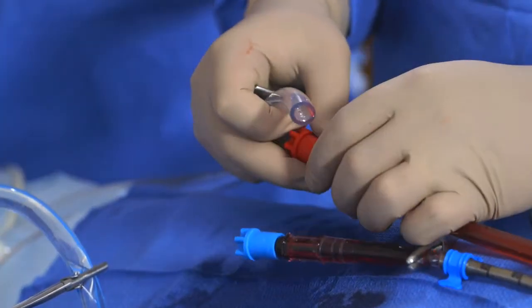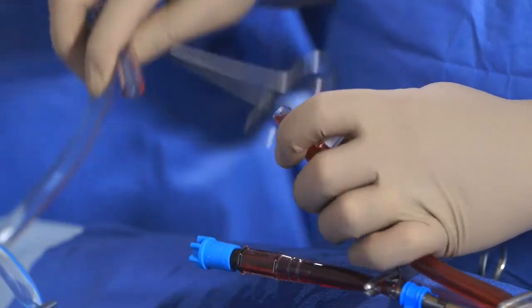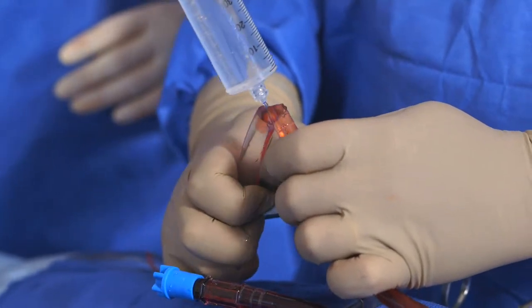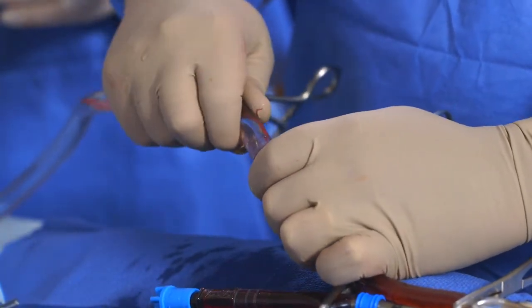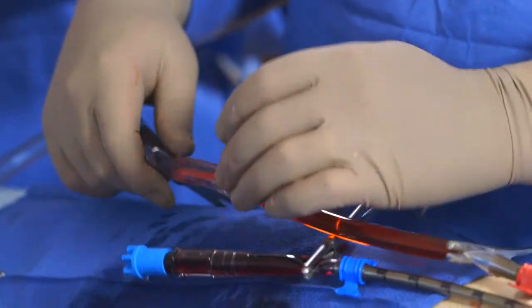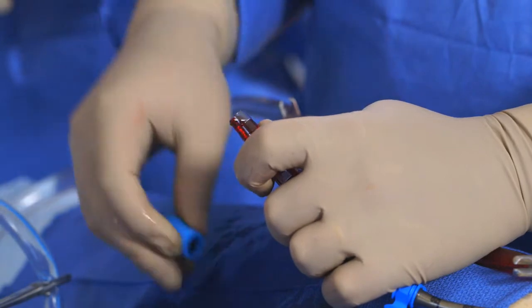Pump connection to the cannulas can now be performed. Connect the pump outflow tubing marked with the red stripe to the arterial cannula using a wet-to-wet connection. Once you have confirmed that all of the air has been purged, insert the tubing over the second barb of the tubing connector.